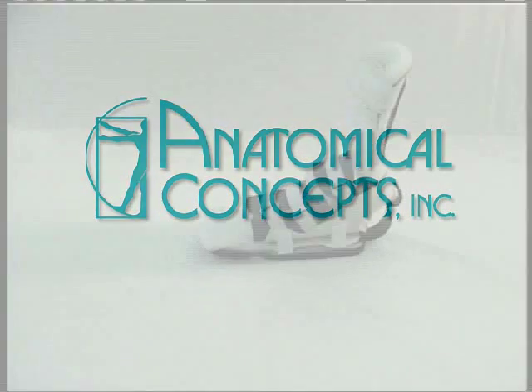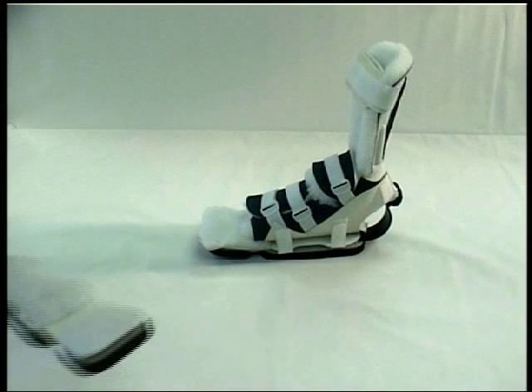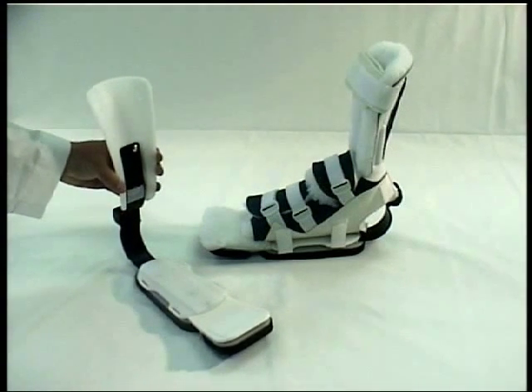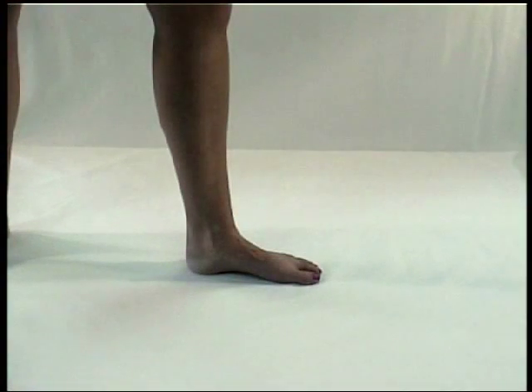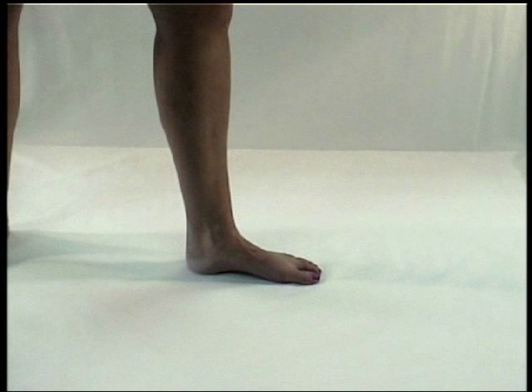For demonstration purposes, we have the PRAFO APU superstructure without the liner system to illustrate the adjustability features more clearly. To custom fit the PRAFO APU or any of Anatomical Concepts' PRAFO family of orthoses, we recommend taking a series of measurements to ensure the proper fitting of the device.